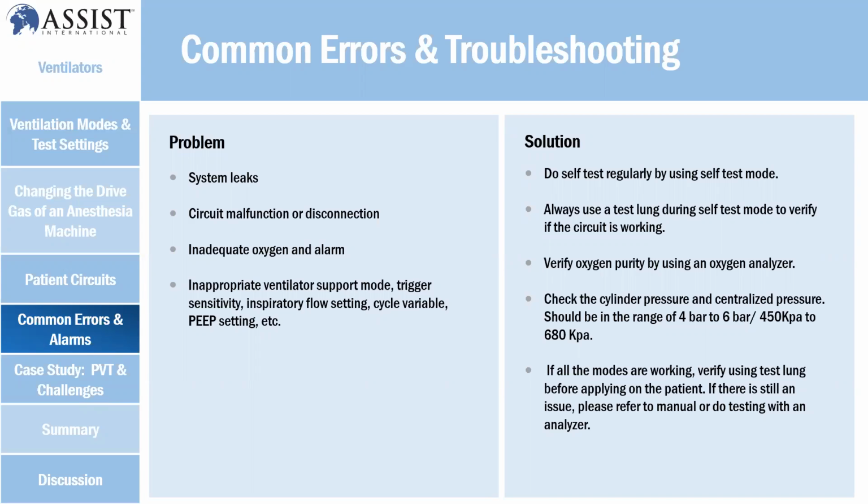But at the same time, make sure you refer to the manual. The user manual plays a very important role because each model has its own way of testing, and each brand has its own way of doing it. So you need to know by the model and the brand, and try to get the user manual, to get to know the ventilator.